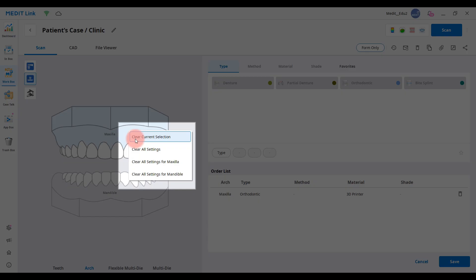If you right-click on the jaw, the following options will appear: clear current selection, clear all settings, clear all settings for maxilla, and clear all settings for mandible.